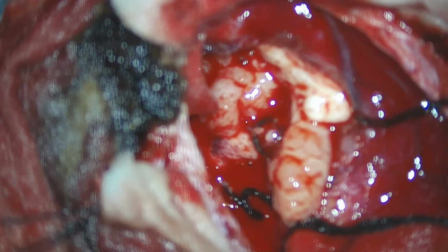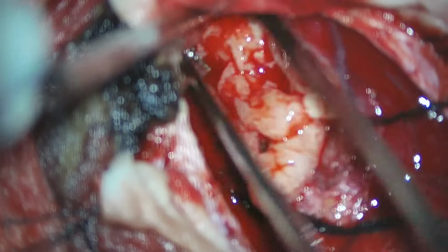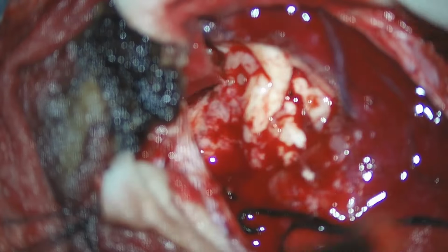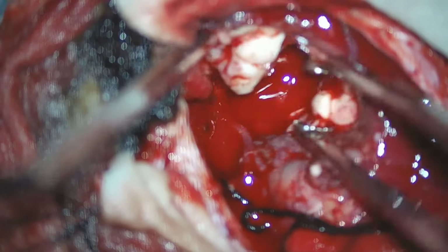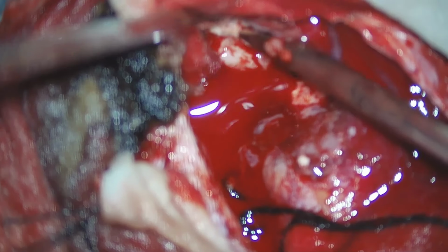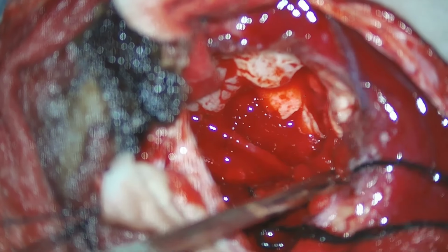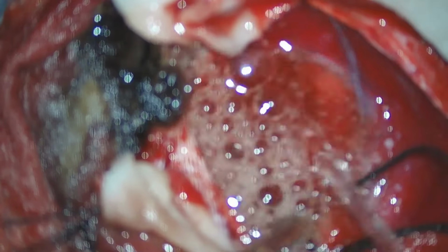We try to preserve all the normal vessels, even the cortical veins, and give a good wash, and we can now again go into the tumor cavity. Still we can see a part of tumor that is adherent to the lateral aspect and the frontal aspect. Now that part is being debrided using a debrider, and we can achieve good removal of the tumor. Only a small part of tumor is still adherent there, that is being debrided.